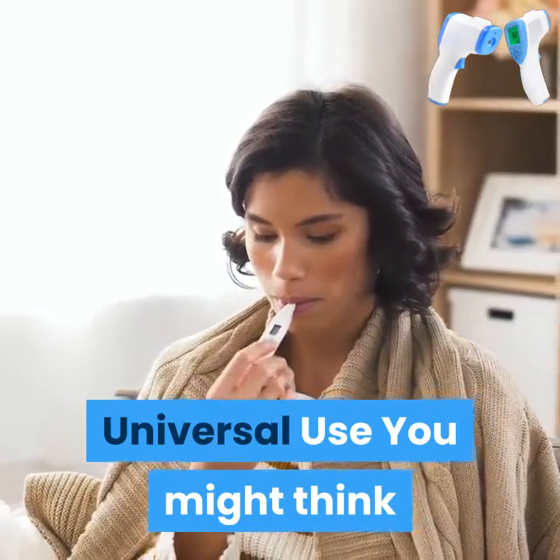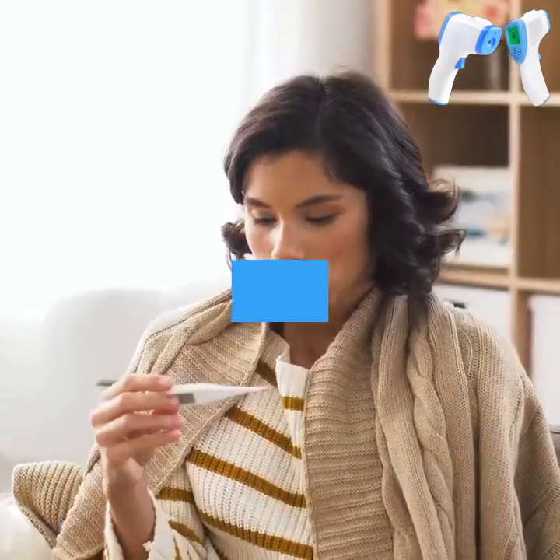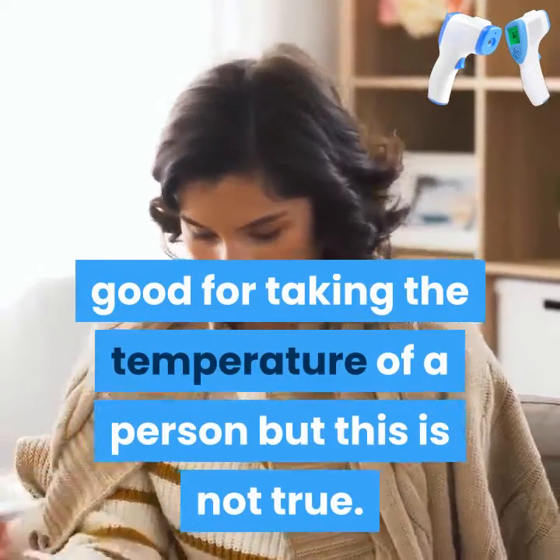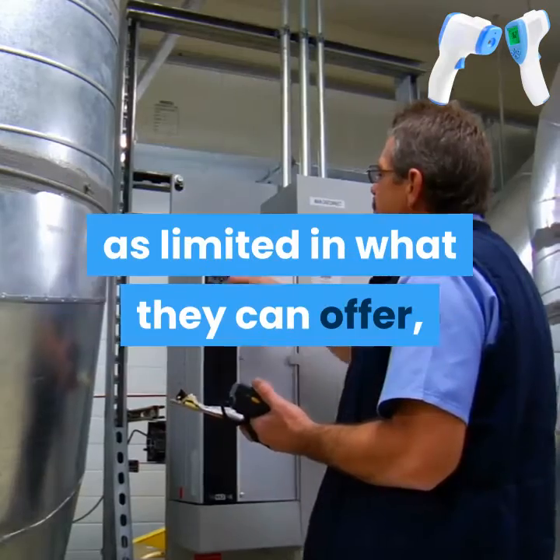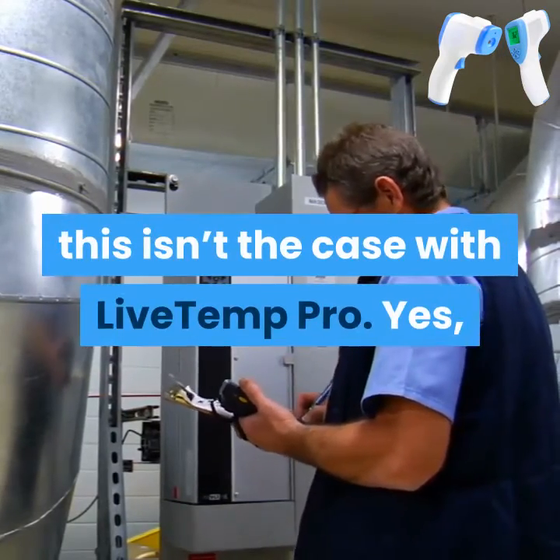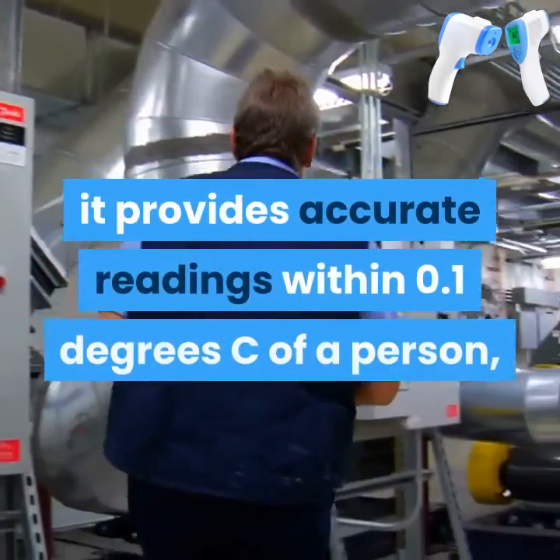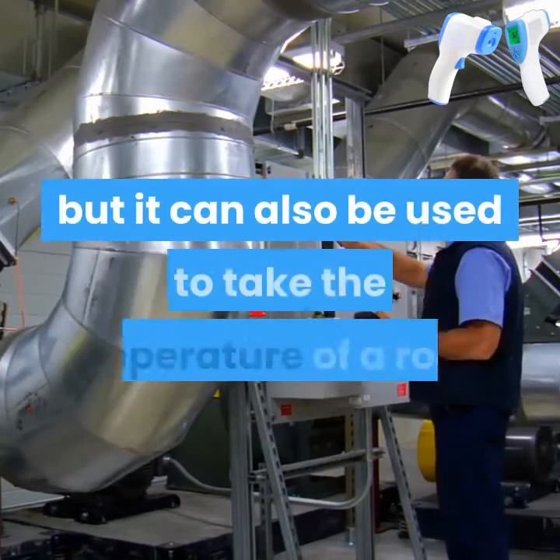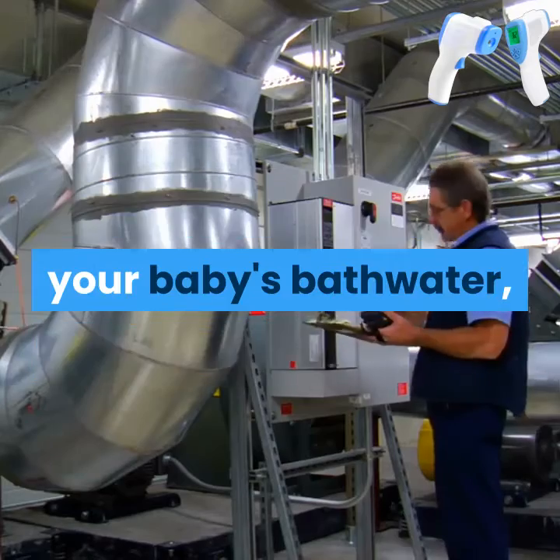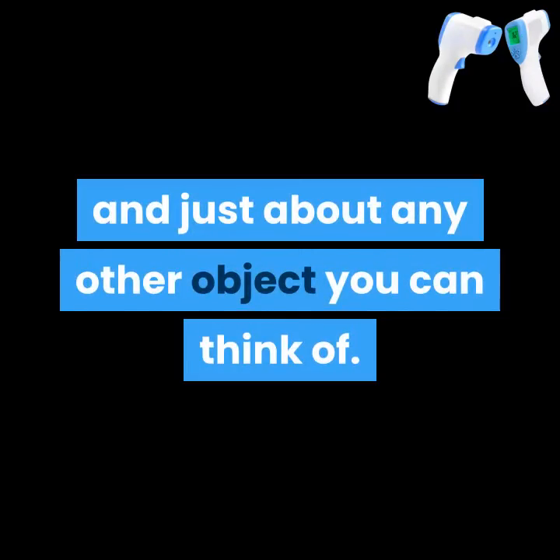Universal use. You might think that a contactless infrared thermometer is only good for taking the temperature of a person, but this is not true. Although there are plenty of products that can be labeled as limited in what they can offer, this isn't the case with Live Temp Pro. Yes, it provides accurate readings within 0.1 degrees Celsius of a person, but it can also be used to take the temperature of a room, your baby's bath water, and just about any other object you can think of.